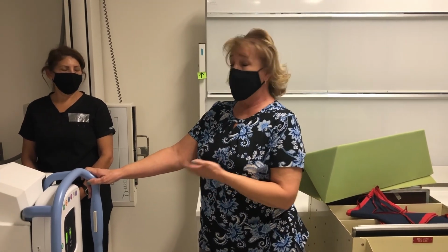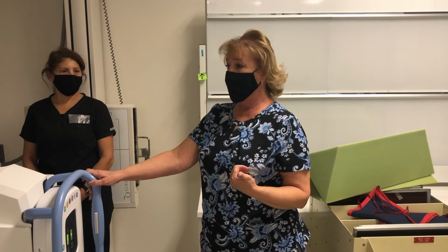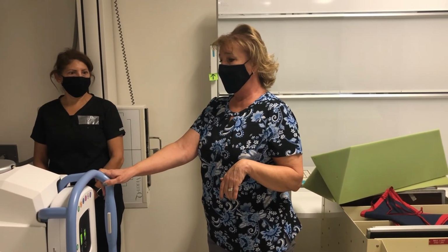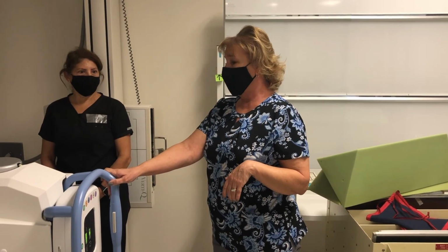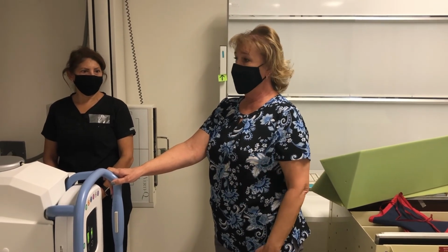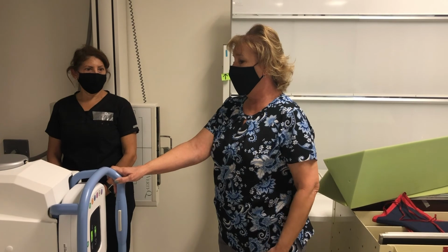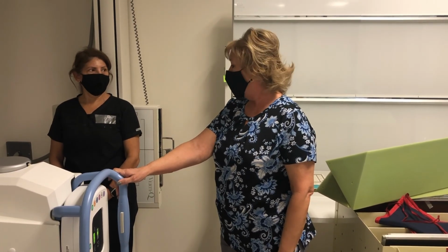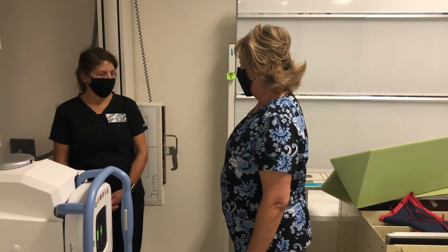She feels fine. I'm comfortable letting her go, and so I'd escort her to the changing room and then ask her if there were any other appointments she might have in the hospital today, such as lab or anything, and then give her those instructions and let her go. So that is IVP.